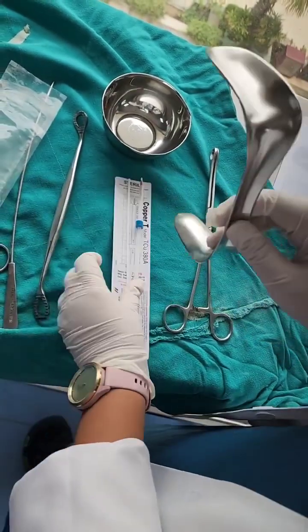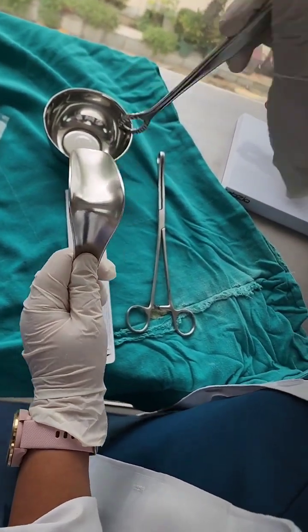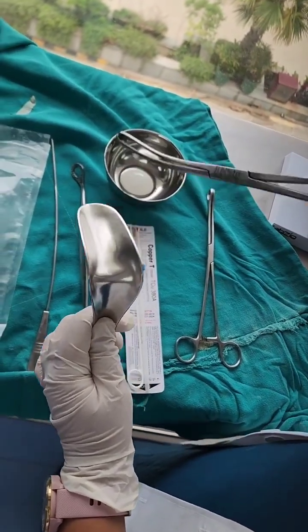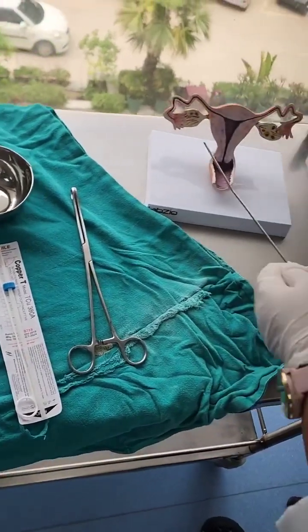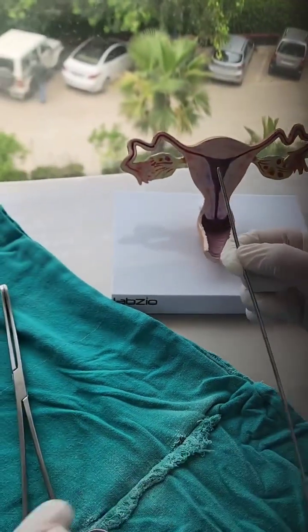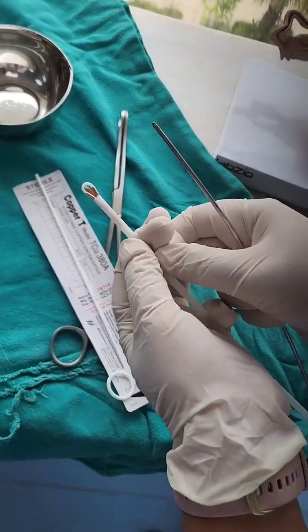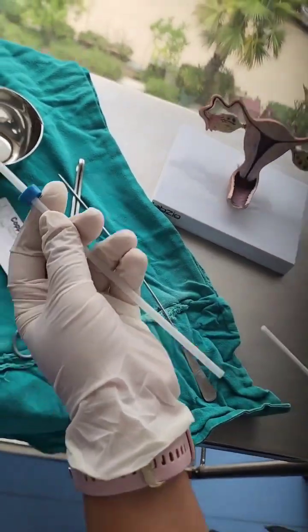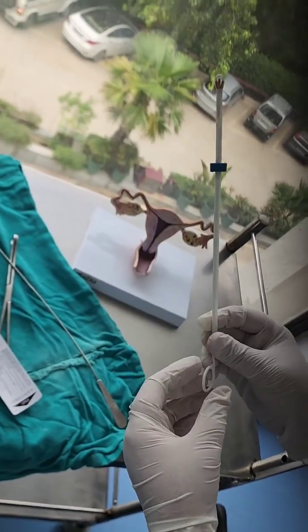We put in the speculum, retract the anterior vaginal wall, visualize the cervix, and hold the anterior lip of the cervix with a Valsellum or a tenaculum. We then insert the uterine sound and measure the uterocervical length. The same measurement is then adjusted on the blue marker of the inserter to set the uterocervical length. We then introduce the plunger inside the inserter and we are now ready to insert the loaded copper T.